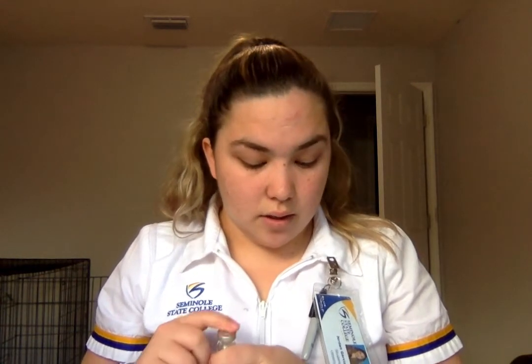And then for the vitamin B12 subcutaneous, Anna Powolowski, 5/5/57, right patient, right med is the vitamin B12. Right dose is 0.5 mLs. I've already done my calculation to know that. Right route is subcutaneous, and right time is 14:58. So I just did my second check. Now I'm going to draw up my medications.